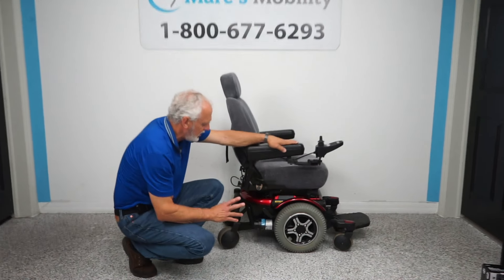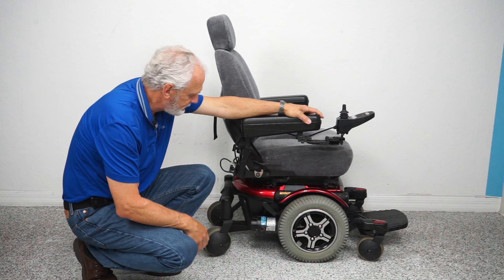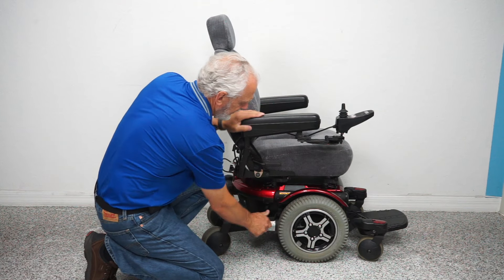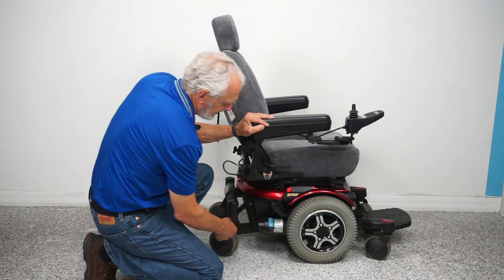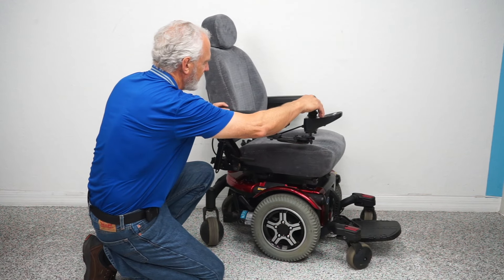The tires are not going to mark your floor. This chair was used for about six months. Now, if you want to push the chair manually, right now it's in gear. You just push the lever down and now you're in neutral. You have to do both motors, and you can roll it just by pushing that lever down. When you're done, put it back in gear and you can still drive the chair.